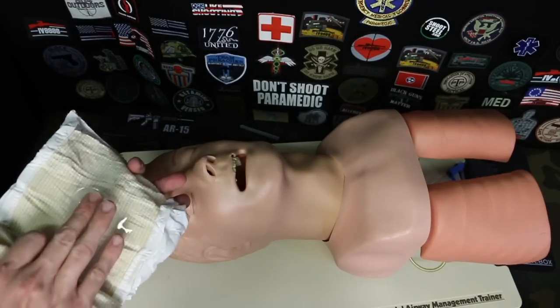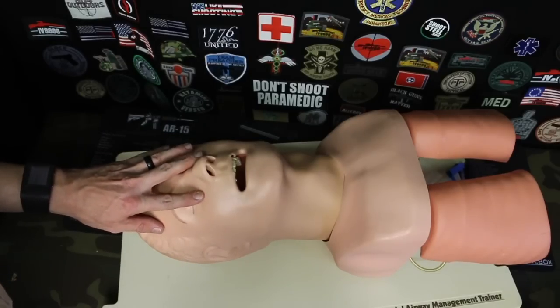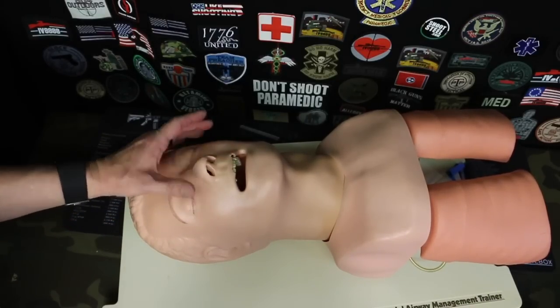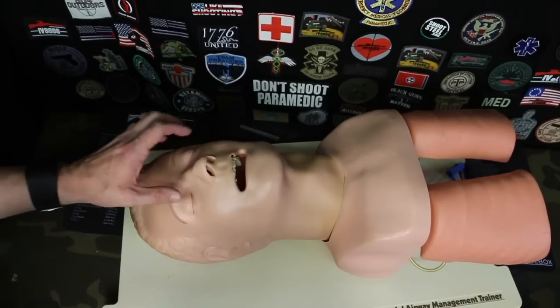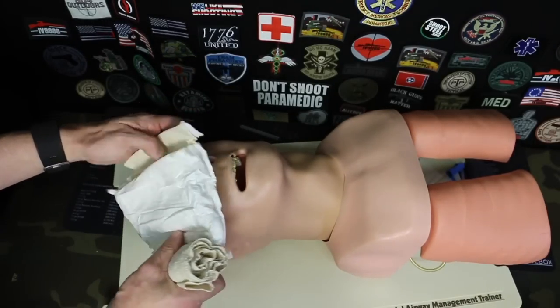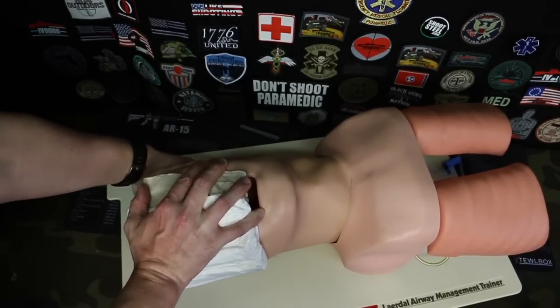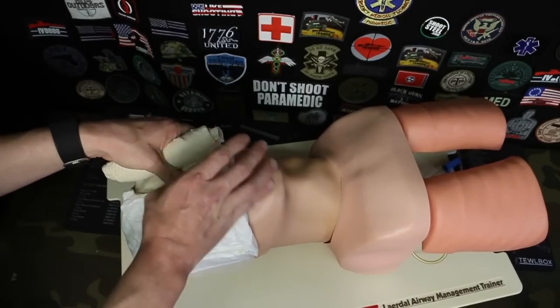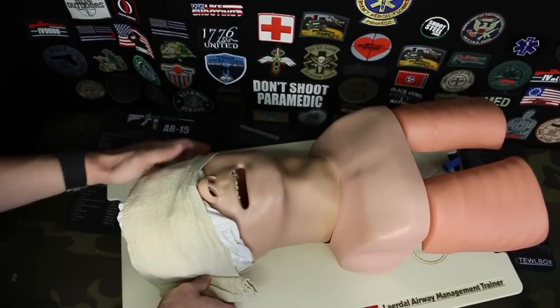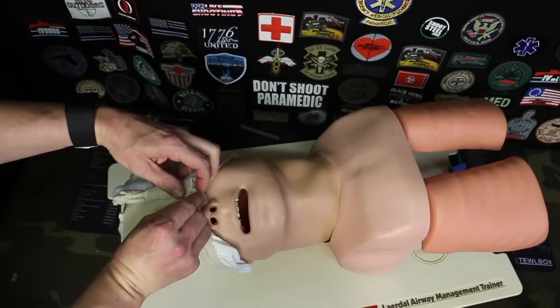Something else you can look at is using this cup here, just reversing it. If someone has an eye injury - whether it's a chemical or a foreign object - you want to cover up both eyes. The patient has to trust you, so you're not going to run them into walls, but you cover both eyes so they don't continue to track with them. You can use the eye cup, reverse it, and then cover their face with the bandage - just be careful not to impede their breathing - and secure it.